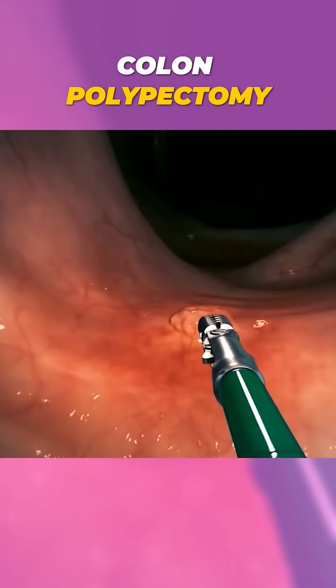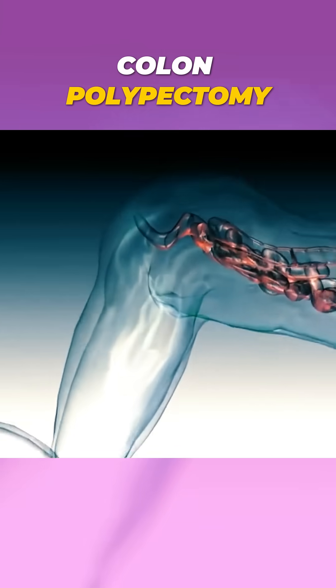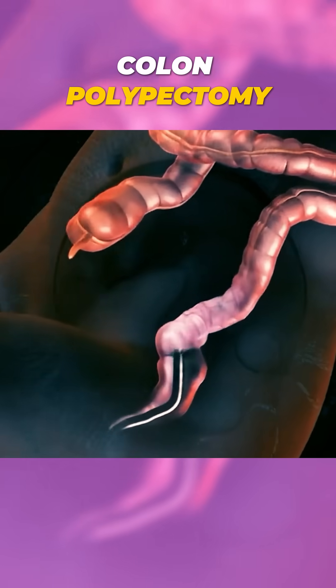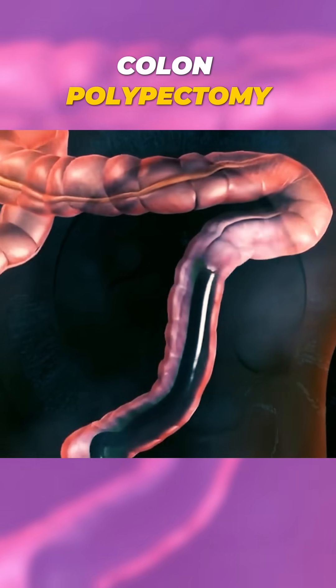Ever wondered how a colon polypectomy is performed? First, a colonoscopy is done where a flexible tube with a tiny camera is gently inserted into the colon.